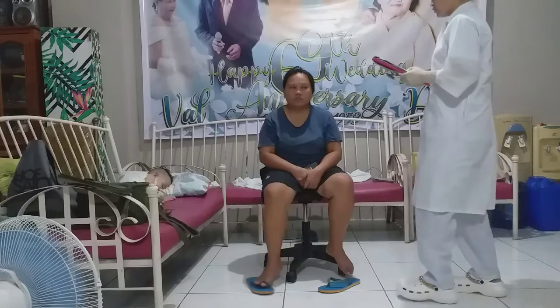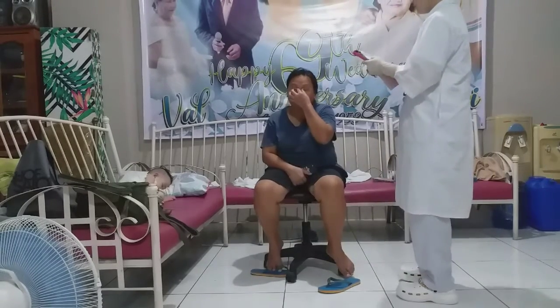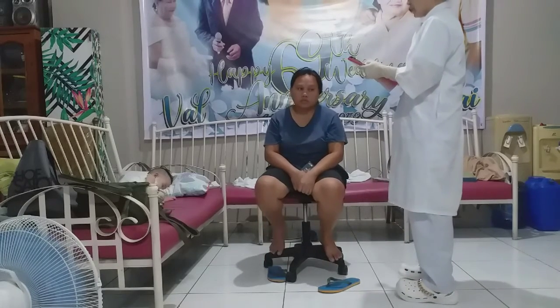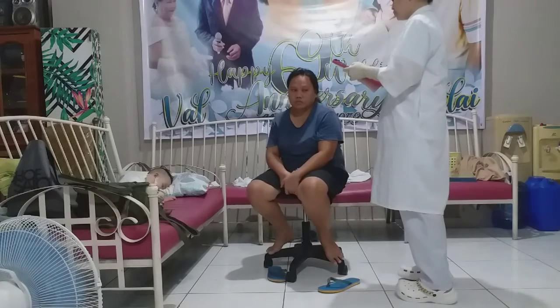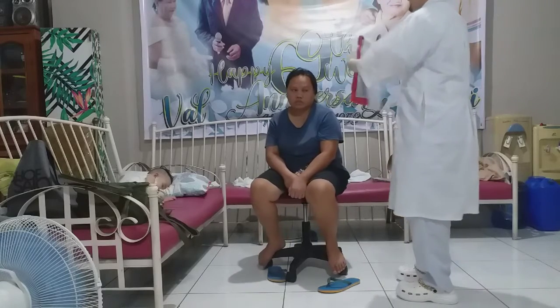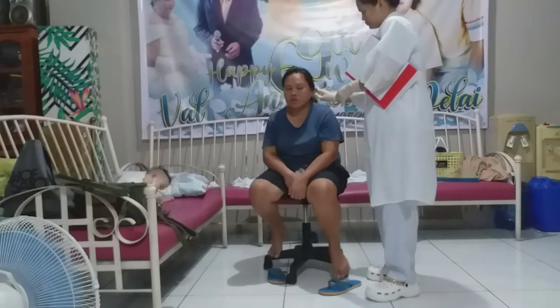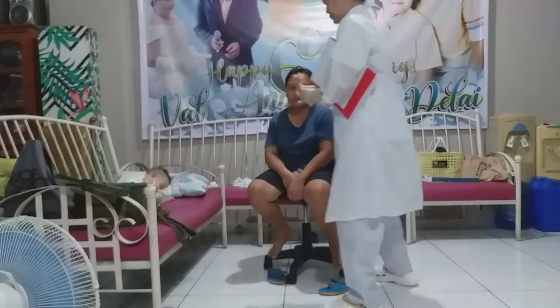So the next thing to do is the Rinne test. I will strike the tuning fork and then put it on the mastoid bone behind your ear and say now when you can no longer hear the vibration. Then I will move the tuning fork beside your ear and say now again when you can no longer hear anything. The other side.